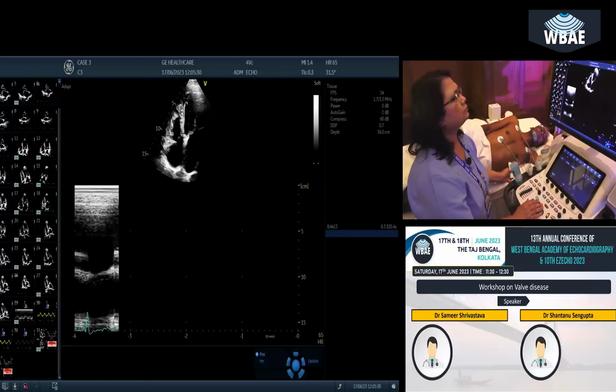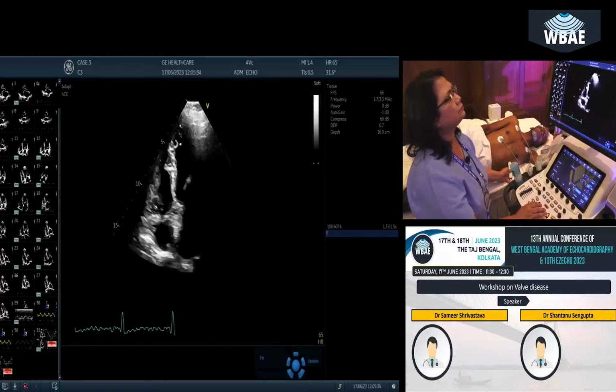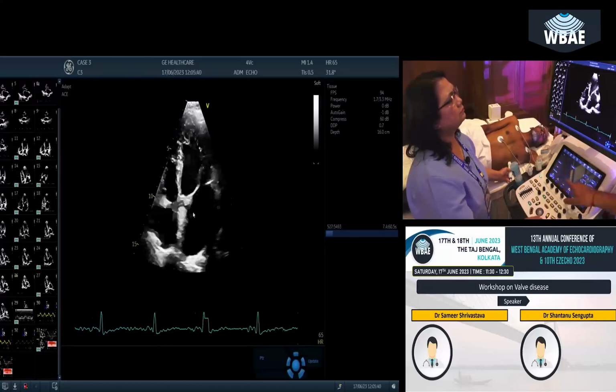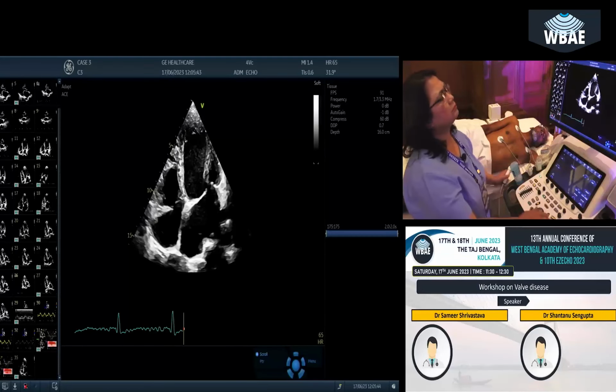Can we now do the mitral valve? Yeah, they wanted chamber, so I will finish off LA there. One question for all of you. You all are doing RV, TAPSE, RV S prime regularly. I have problems, so let me give a situation. COPD, cor pulmonale, those kind of patients.